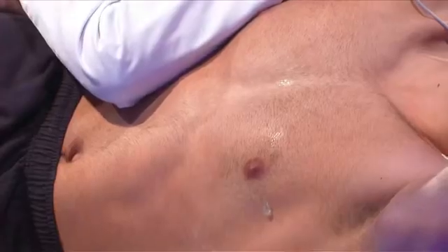To conclude, I would say that this is a very typical example of a Takotsubo cardiomyopathy, the most important features being the normal contraction of the basal segments, the bulging and hypokinetic apex, and the presence of wall motion abnormalities with a non-coronary artery distribution. It's not typical of any coronary artery lesion. It affects all the segments of the apex, and in this specific case also the medial segments of all LV walls. Therefore, a non-coronary artery disease pattern.